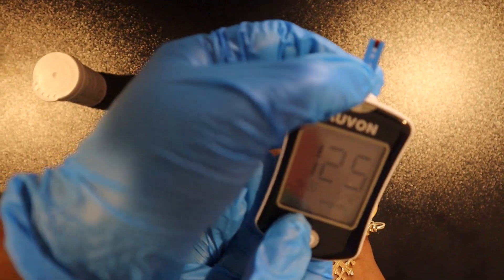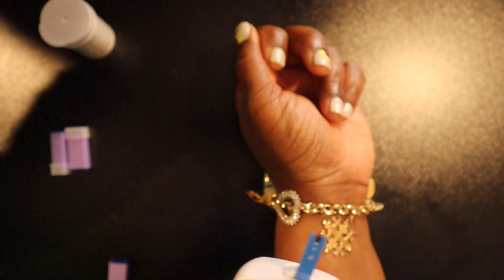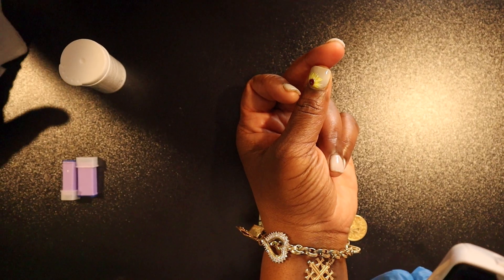As you can see, her reading is 125, which is perfect — we both just had a pumpkin spice latte. Be sure to assess the puncture site for active bleeding.